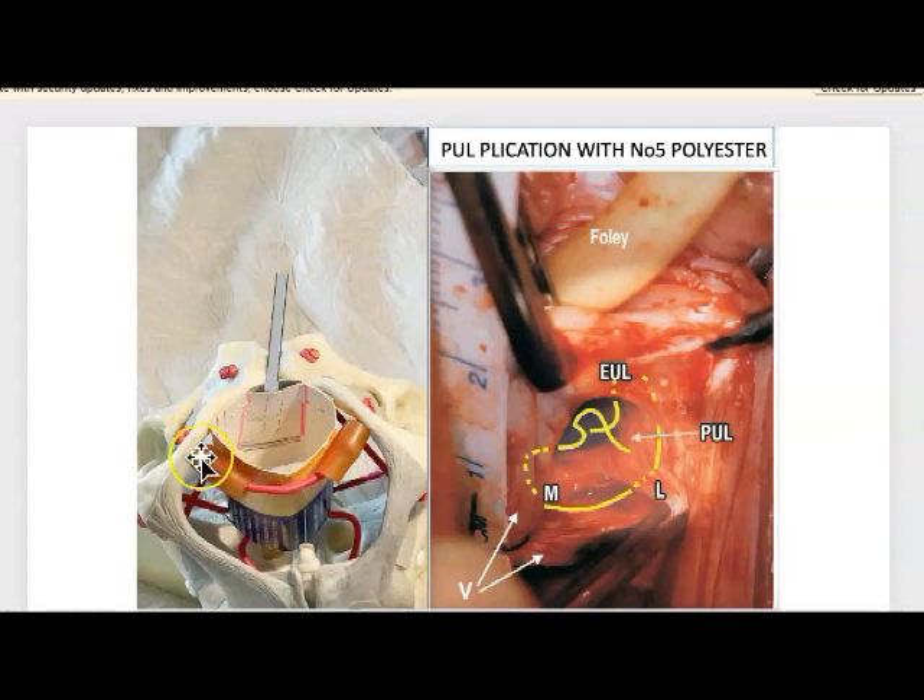Here is a pelvis: pubic symphysis, descending ramus, here is the vagina — anterior vaginal wall — here is the posterior vaginal wall, perineal body, and these are the deep transversus perineal ligaments. On the right hand side is an actual operation. The sulci are here, this is the bladder neck, this is the periurethral sulcus on the left and right side — that's where we make the incisions. The sutures go from here up behind the symphysis and back down. Coming across is what we call the external ligament, also called the anterior pubourethral ligament, which sits right on the anterior surface of the pubic bone.